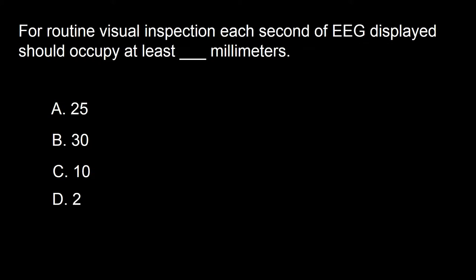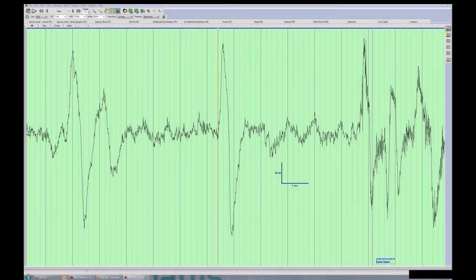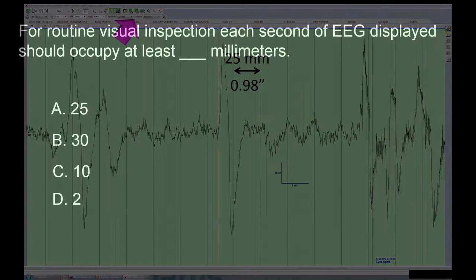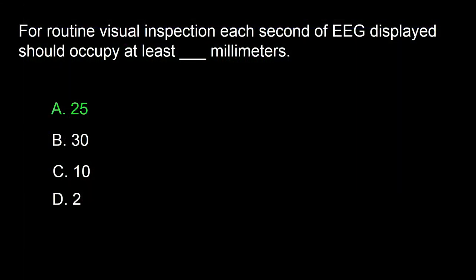Next question: for routine visual inspection, each second of EEG displayed should occupy at least dash millimeters. A: 25, B: 30, C: 10, D: 2. In the shown EEG epoch, the space between the thick green lines represents one second. A second should occupy at least 25 millimeters. This may vary based on time base used, but all computer displays should have the capability to display one second in 25 millimeters. The answer is A.